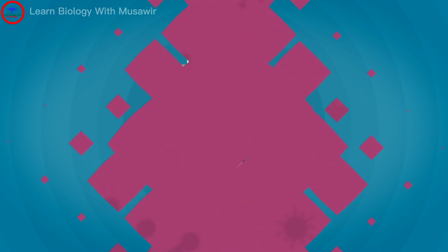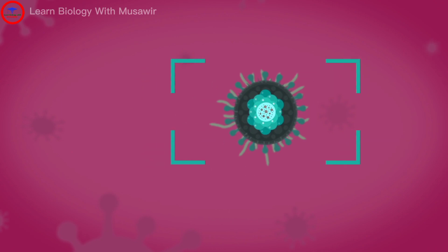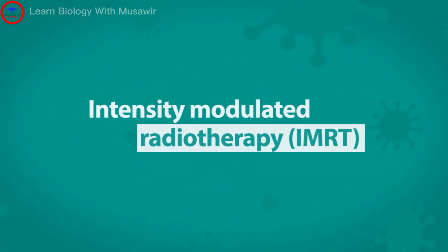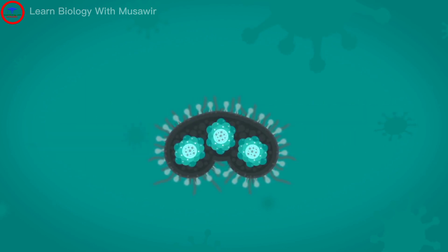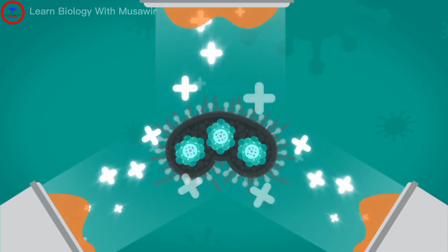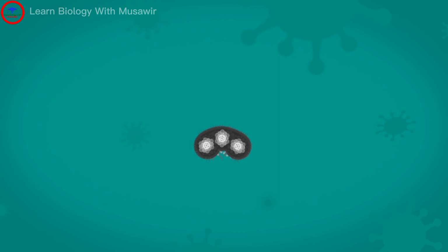The latest technology includes image-guided radiotherapy. This involves collecting images to check a tumor's position before treatment is given. With IGRT, the risk of part of the tumor being missed by the X-ray beams is reduced. Intensity-modulated radiotherapy. This specialized way is now used to treat many different types of cancer. IMRT is a way of the radiographer molding and varying the strength of each beam to match the size, shape, and position of the tumor, and can do this more precisely than conventional or conformal radiotherapy. This allows the treatment to be just as effective while reducing the side effects.